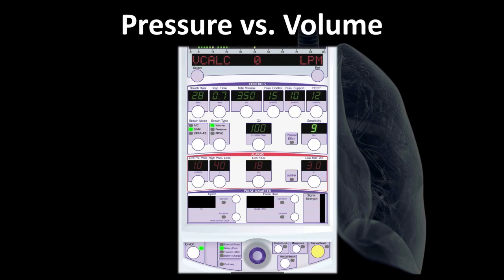When we contrast that with, let's say, the Revel ventilator, the Revel ventilator is a volume or pressure delivered ventilator. You can pick each one. And so I guess the point here is there's not a hard, fast rule. What I would say on the Hamilton is you only have one method, right? You have to use a pressure breath. It's just in how you want that done. Do you want the ventilator to regulate that for you to achieve a tidal volume, or do you want to turn the knob up and down? I personally like to turn the knob up and down and adjust it myself.